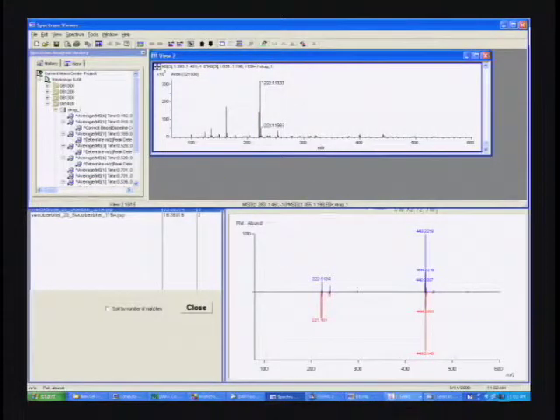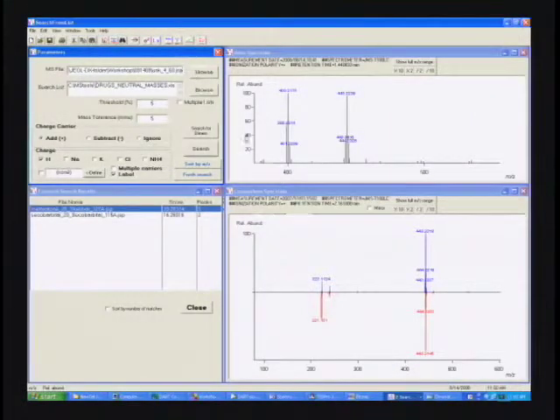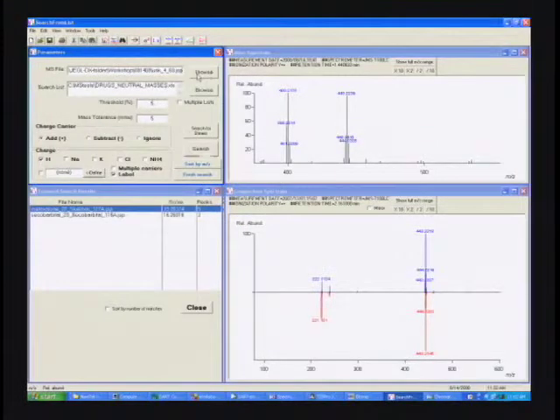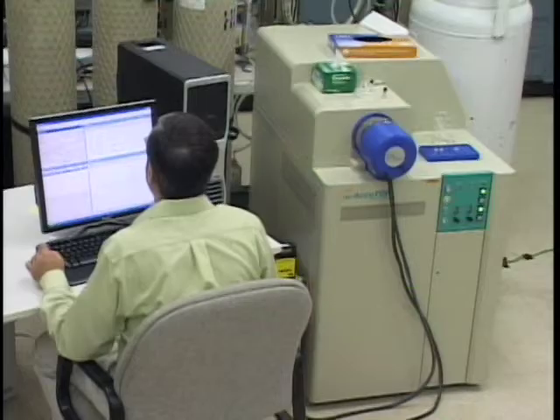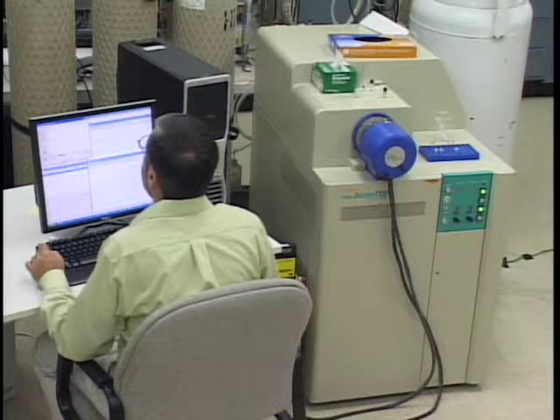Replace that. And that is not what I'm expecting it to be, despite the fact that I've navigated to the correct location here.